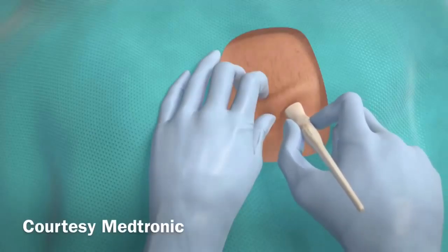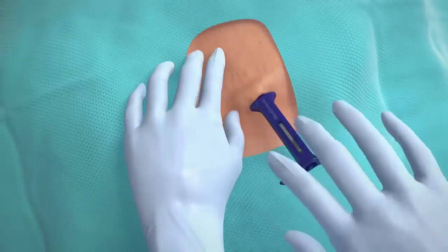I think this thing lasts about three years, maybe longer depending on how often you're using it. It's an incredible diagnostic tool — something this small being able to last as long as it does. It gives you peace of mind to have up to three years of recording so you can catch those events. Some people have pretty significant heart events but they only happen once in a great while, so it may be worth asking your doctor about it. I asked mine and I think I was the first patient he implanted it on because he seemed kind of giddy about it. If you're constantly going back to specialists and doing Holter monitors with no results, it might be a good idea to ask if it could catch the events you're having.